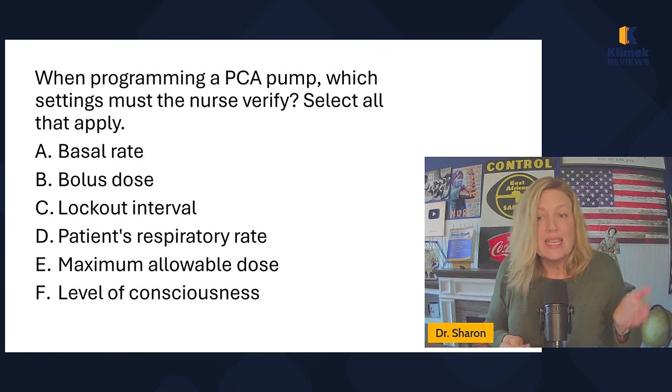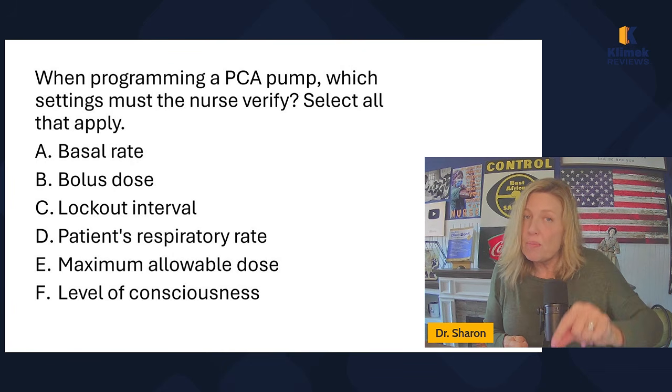Patient's respiratory rate. That is not something I program in. Do I want to assess the respiratory rate? Yes. But this is about programming the PCA pump. I don't put that into the program.